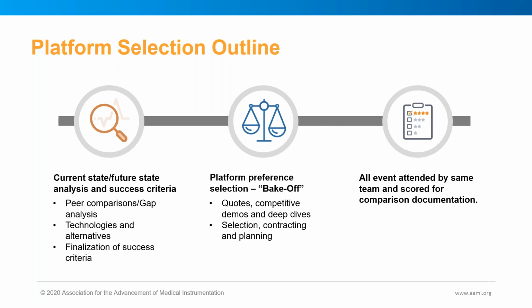effectively. For Parkland, they had already seen various tools. Their IT security department had looked at a few tools, and the HTM team had looked at a few tools, and the group really decided that they needed to get together and put together an overall regimented program around the selection of a platform that would give them visibility into primarily medical devices as well as the other Internet of Things devices out there.